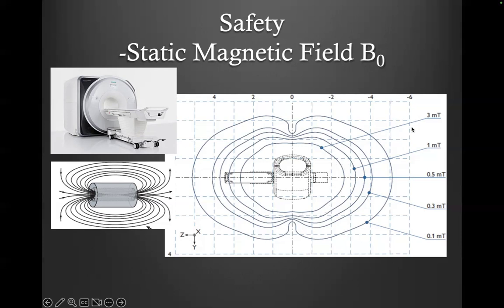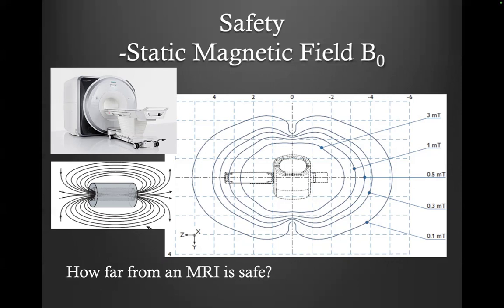This line is 3 millitesla, this line is 1 millitesla, and this line is 0.5 millitesla.